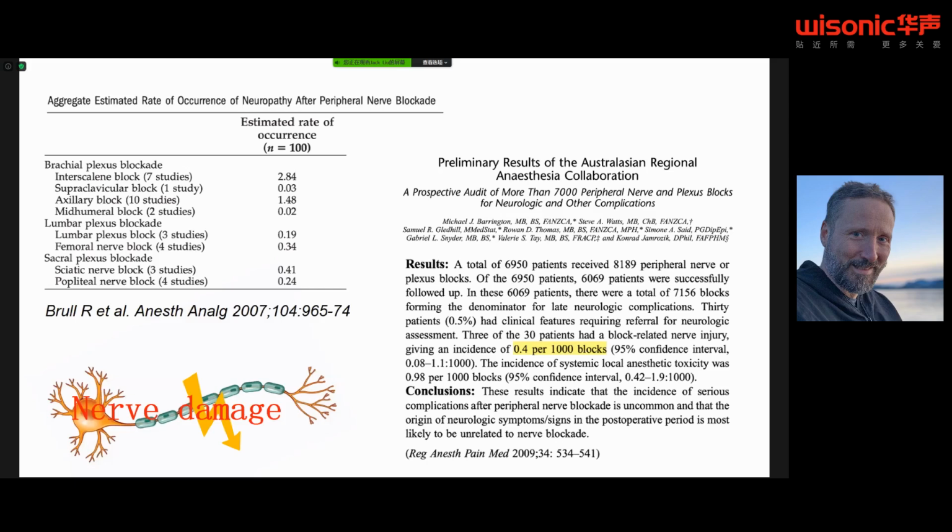Some colleagues would suggest that there are more anesthesiologists performing regional anesthesia with ultrasound compared to the time when only nerve stimulation was available, and that many of these colleagues are not adequately trained to perform nerve blocks in a safe way. Another explanation might be that while using ultrasound and having the possibility to see our nerves and see the needle and the needle tip, we are encouraged to go closer to the nerve, and that we even want to make several attempts to obtain an optimal local anesthetic distribution around our target nerves, so that we are unwillingly getting more aggressive towards the barrier of the nerve compared to when we were using nerve stimulation in former days.